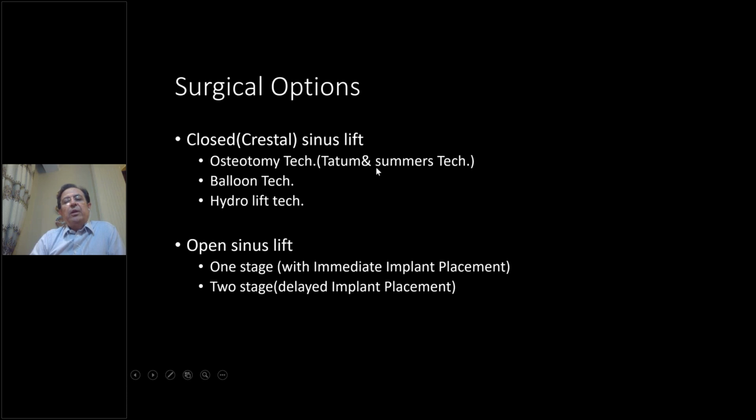Nowadays we know this technique as the Summers technique, the balloon technique or the hydrolift technique. And the open sinus lift, which we must discuss more. It can be done at one stage with immediate implant placement or two stage with delayed implant placement.